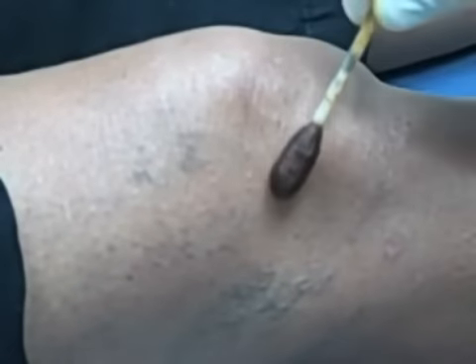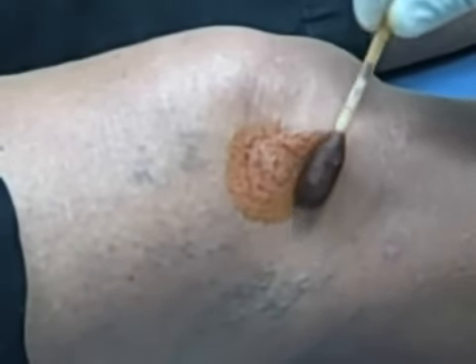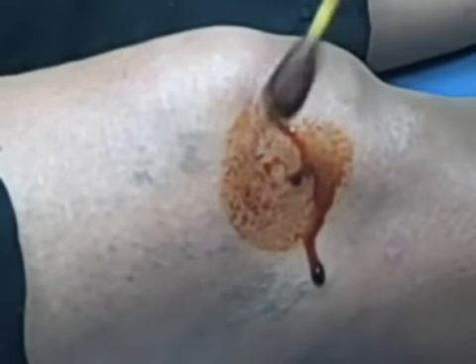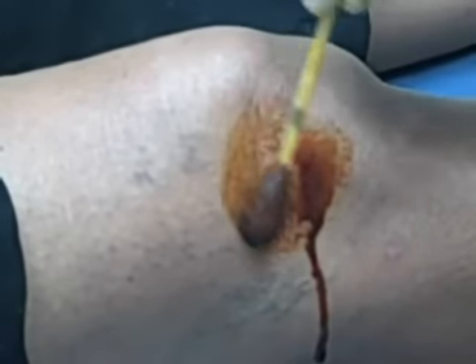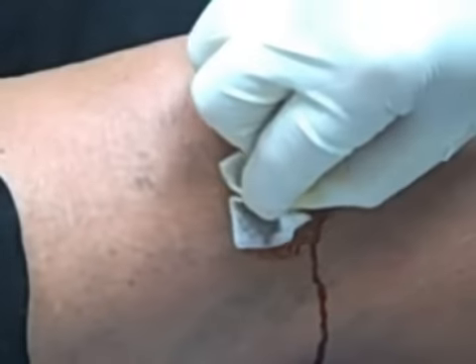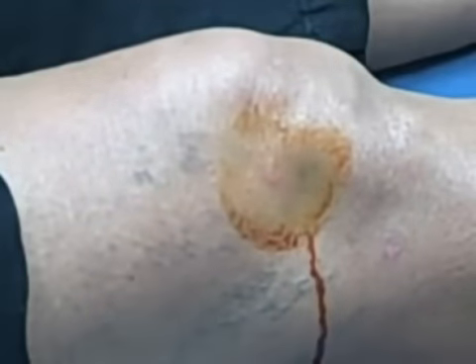the skin using betadine and or alcohol solutions. Our medications that we're going to be using today will be 2 milliliters of a 1% sodium hyaluronate solution, and for our clinic we use Euflexa, but you can also use Synvisc, Hyalgan, or any other visco supplement. We're also going to be using a 22 gauge 1.5 inch needle for the injection.